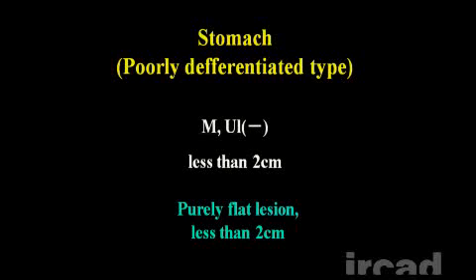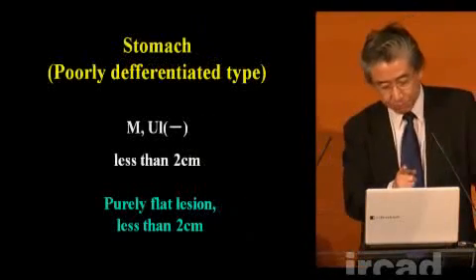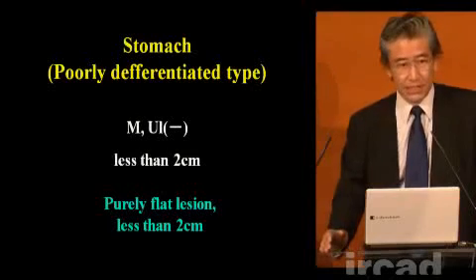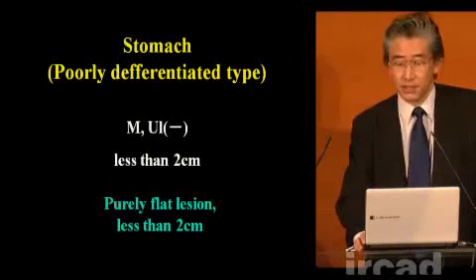So definitely mucosal and no ulcer scar. So please take care. So less than 2 centimeter region. So in other words, a purely flat lesion less than 2 centimeter is a candidate for mucosal resection.